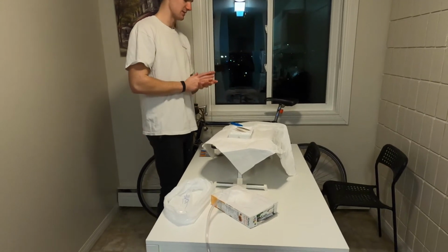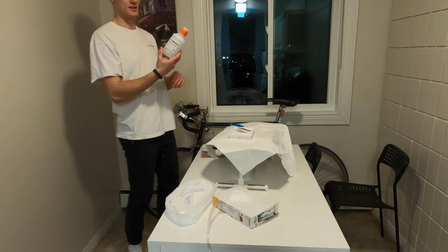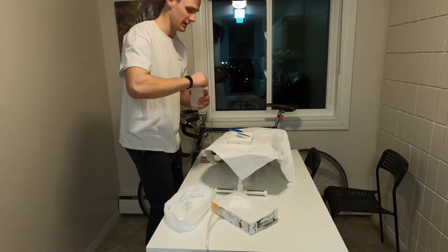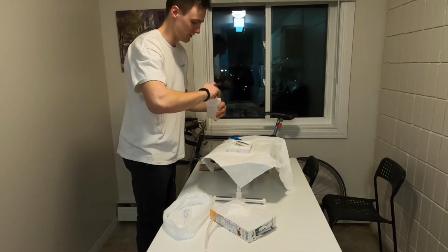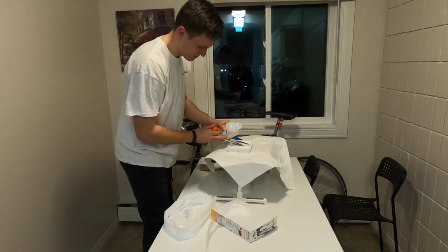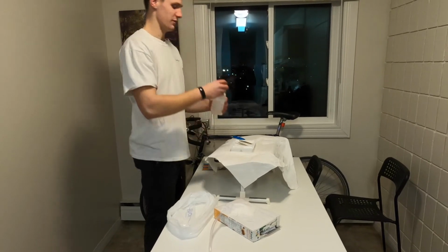So I can start adding things now. So I got my sterile water or my normal saline. I'm checking to see if it's expired. It isn't, so I can just add this to my tray here. Making sure I don't drip anywhere outside my tray. Just need a little bit here. Perfect.